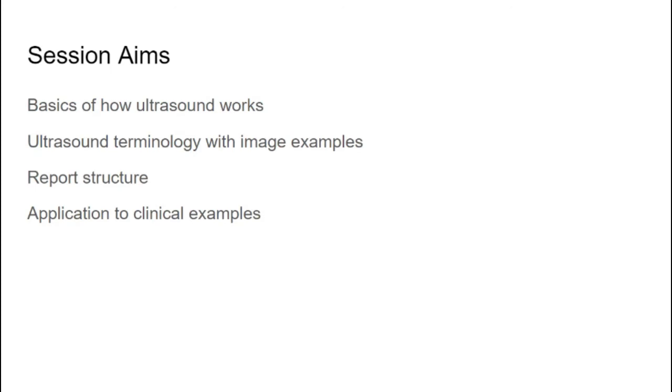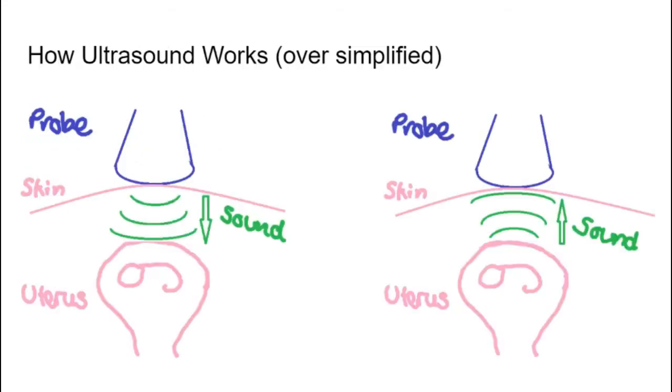So the things that I'm hoping to cover today are the basics about how ultrasound works, the terminology that we use to describe images in ultrasound and what these images might look like, how an ultrasound report is structured and how to access that key information, and we'll look at a few clinical examples.